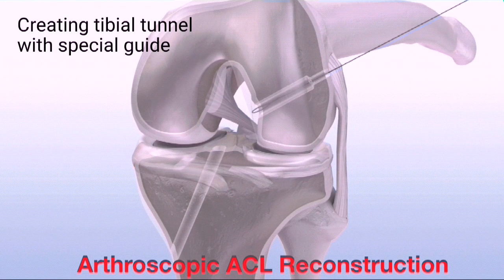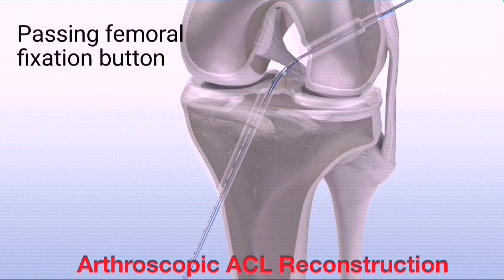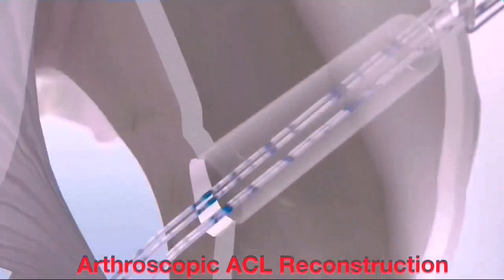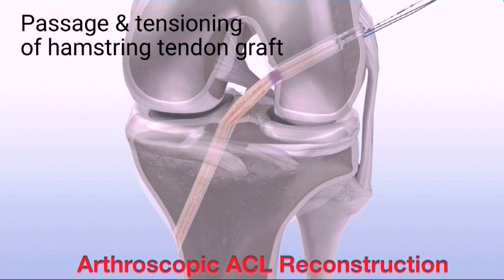Ream the tibial tunnel. Then retrieve the passing suture through the tibial tunnel. Load the blue and striped suture tails of the GraftMax button into the passing suture. Pull up through the knee so that all four suture tails exit the skin. Advance the button through the bone tunnels by pulling on the blue lead suture while carefully removing any slack in the striped adjusting sutures along the way.